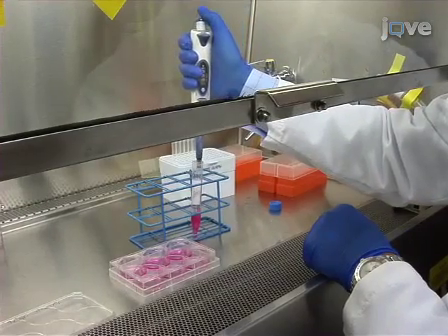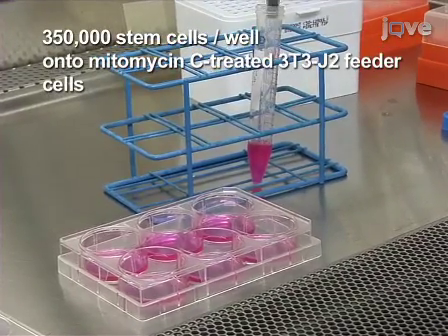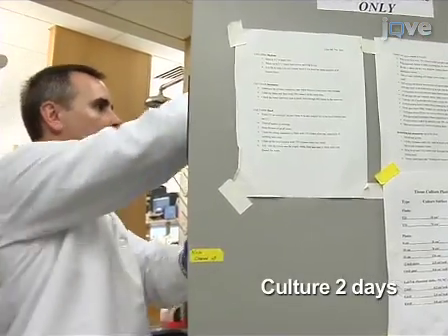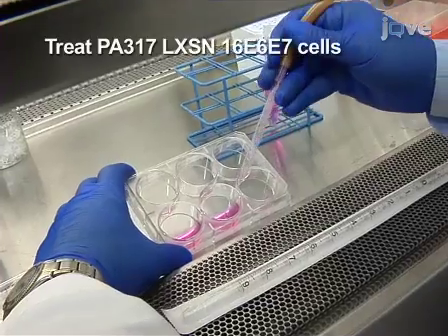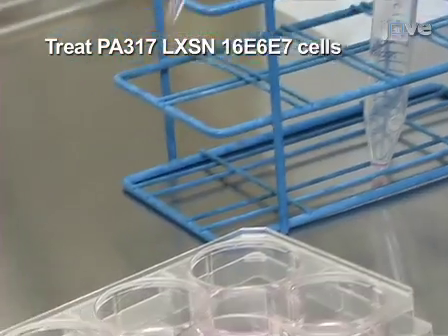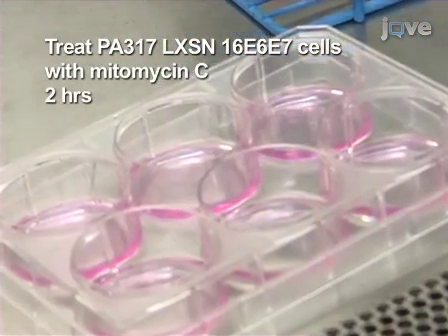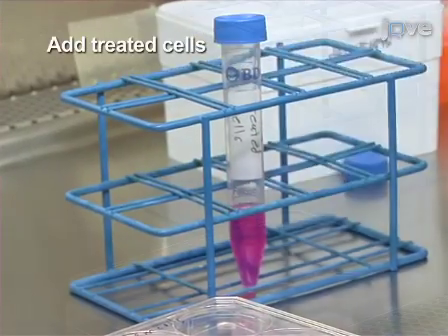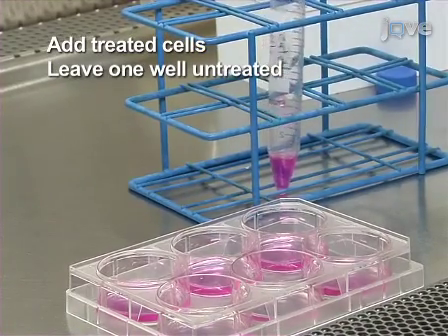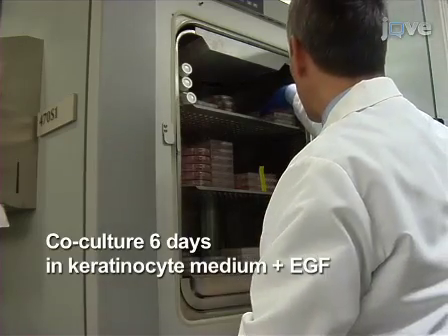To immortalize the stem cells, plate 350,000 stem cells per well of a six-well plate onto a layer of mitomycin C 3T3-J2 feeder cells. Culture the cells for two days. On the second day, treat PA317 LXSN 16E6/E7 cells, which encode HPV 16 E6 and E7, with mitomycin C for two hours as described in the written protocol. After the incubation, add the treated cells to the primary epithelial stem cells, leaving one well of stem cells untreated as a selection control. Co-culture for six days in keratinocyte medium with EGF, changing the media every two days.